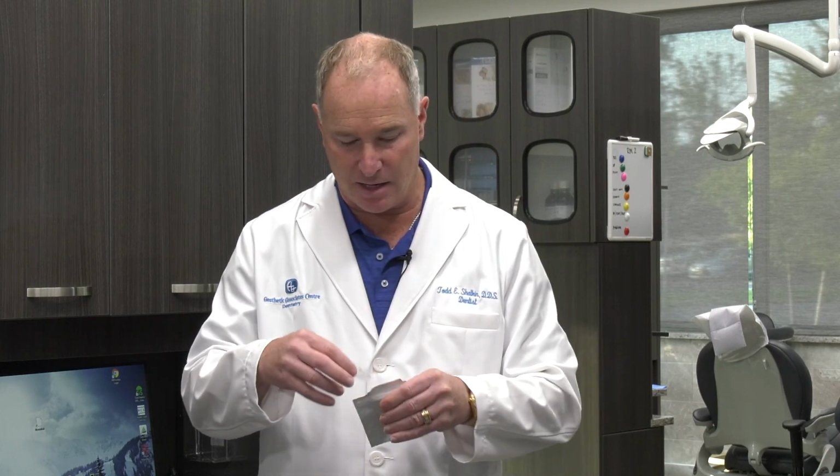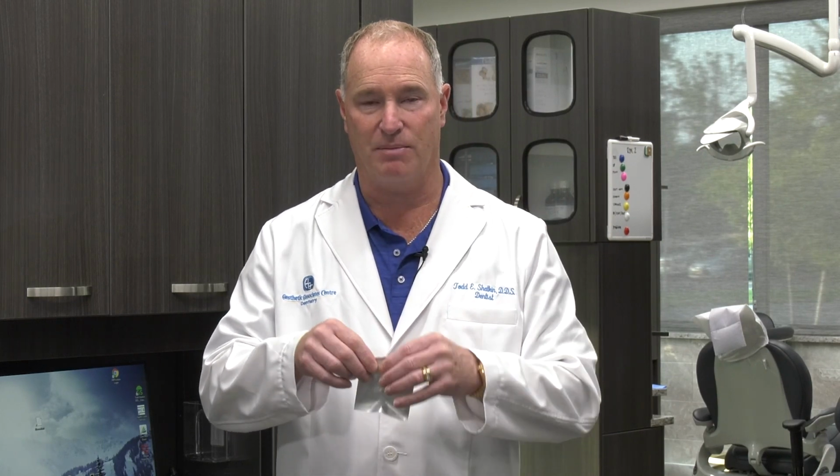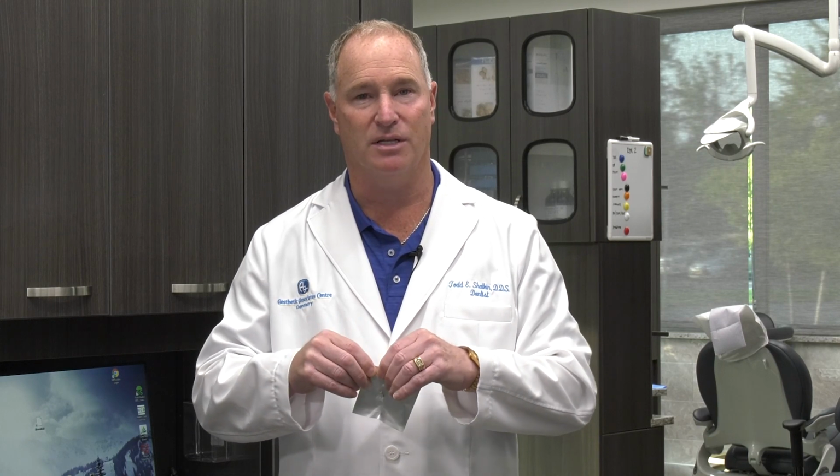These are all the reasons why you should use a surgical guide when placing mini implants. But most importantly, medical-legally, you've got pre-planning done with a surgical guide stent. If you ever run into any issues at all, you've gone through the proper process and due diligence to treat that patient. You want to document all that, and you want to keep the surgical guide stent with the patient's name on it in a sealed bag so that you never lose it. And you keep it as part of the patient's models and records, at least for the minimal amount of time that your state requires you to keep records. In New York State, it's 7 years.